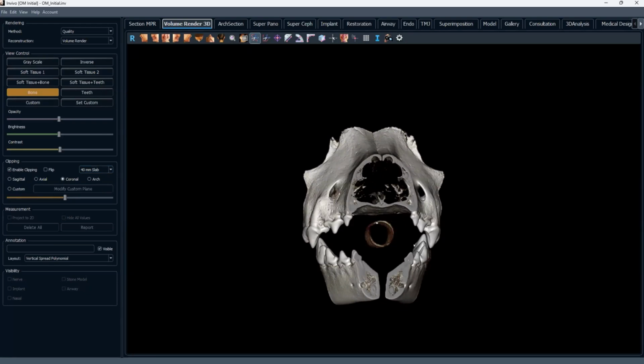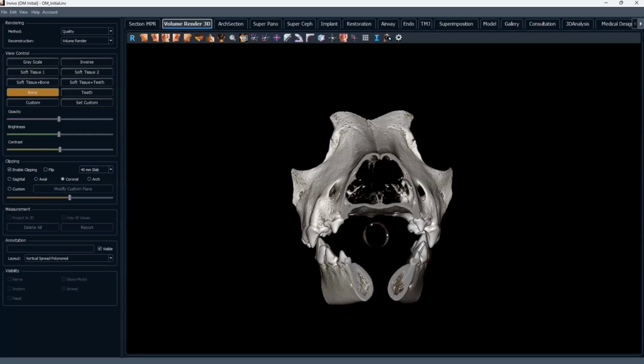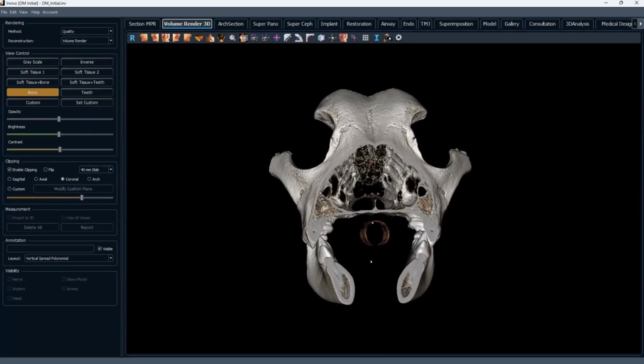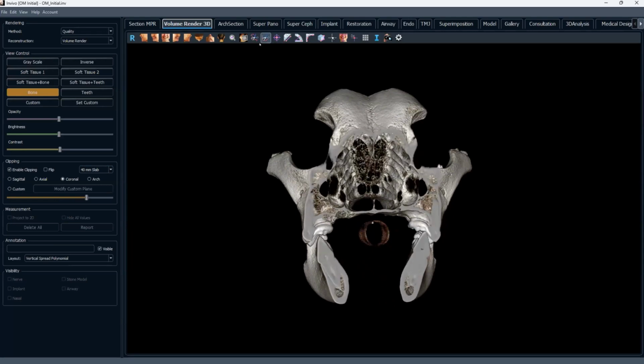You can take out all sorts of stuff. If you just need to get it out of your way without cutting into the relevant anatomy, that might happen if you just use the clipping tool. If we use the polygon, sometimes it's easier. You just click each spot on the line and make a polygon shape. When you're done, you double click. And if I click outside the circle, everything goes away. Inside the shape, just what's inside goes away.